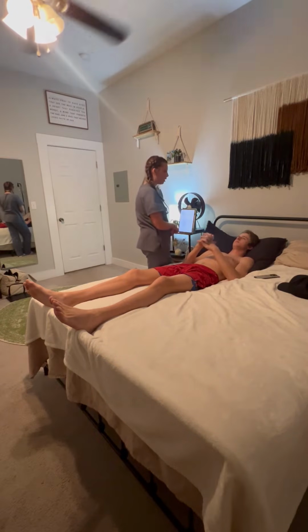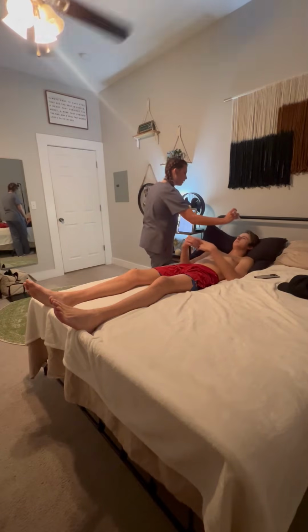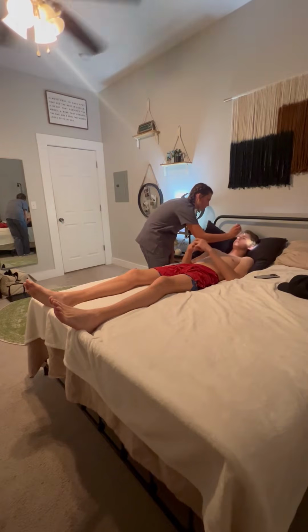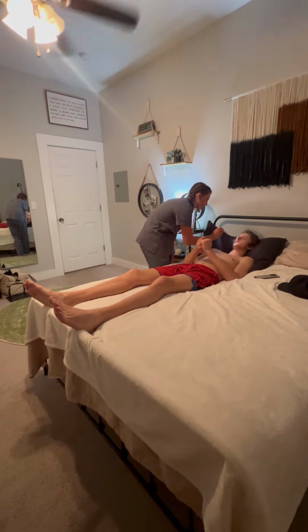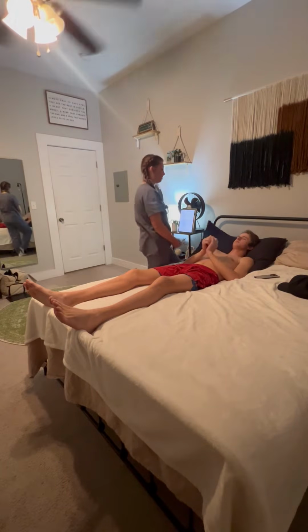So the next thing that we're going to do is I'm going to be checking your reactiveness to light. So if you could just keep looking straight for me, I'm going to move this light in closer to your eye. I'm just going to be checking to make sure that your pupil constricts on both sides. Okay, those were both equal.